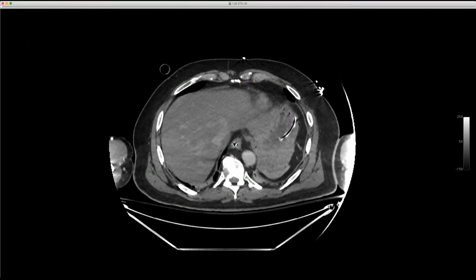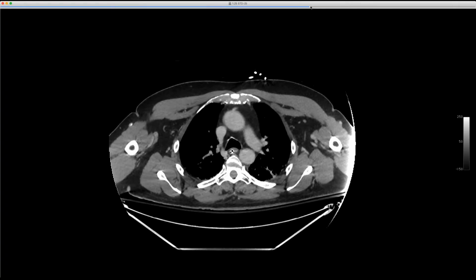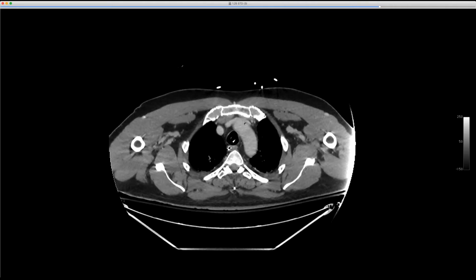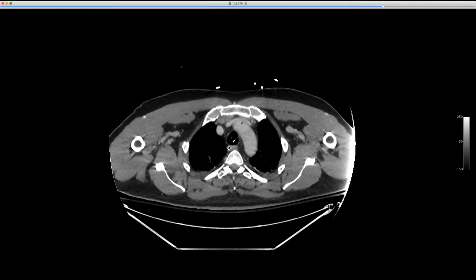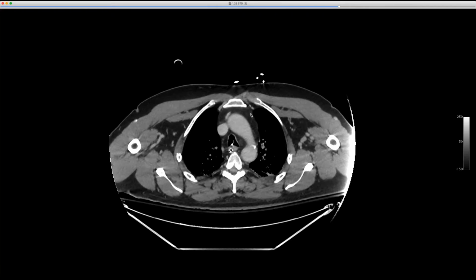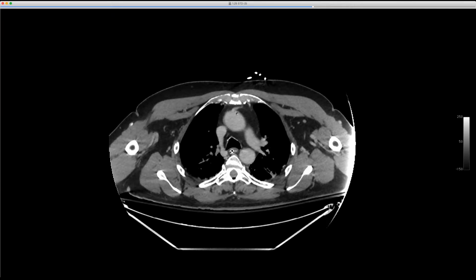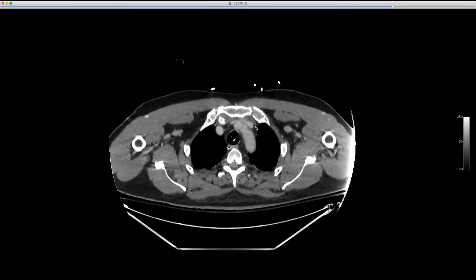All right, you guys should be seeing a CT. This is just a quick case, but it's a cute finding that Daniela showed me. I think we've seen one of these before, but this was a trauma study, and you can see there's a small brachiocephalic vein that's compressed between the sternum and the aorta, and then there's this little second arcing vessel that courses anteriorly to the ascending aorta that comes back up and communicates with the brachiocephalic.